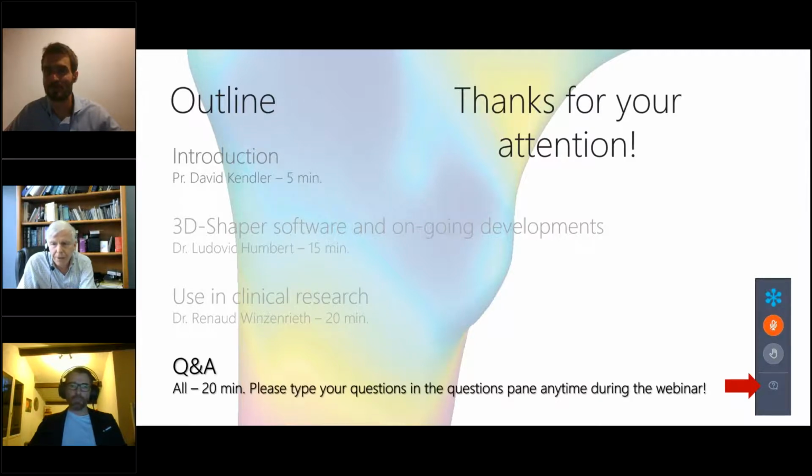Okay, thank you very much, Ludo. And a related question also from Dan, asking whether 3D-Shaper has been used on different technologies, comparing the results, say, with a GE scanner and a Hologic scanner. Are there differences or similarities, or has that been done yet? Sorry, I thought this question was for Renaud. Our measurements are standardized, so there is no significant difference between 3D-Shaper measurements when measured from GE devices or Hologic devices, because we have this standardization that is integrated in our software.